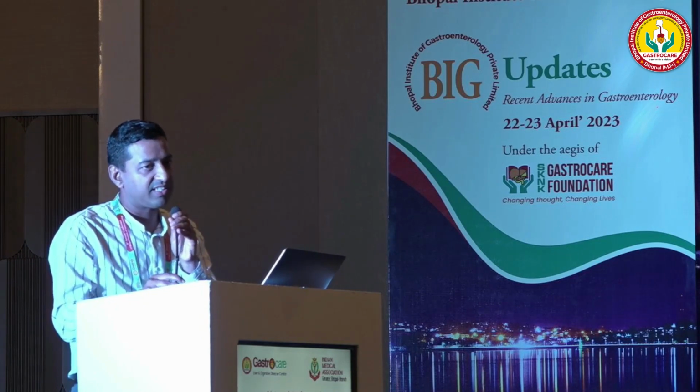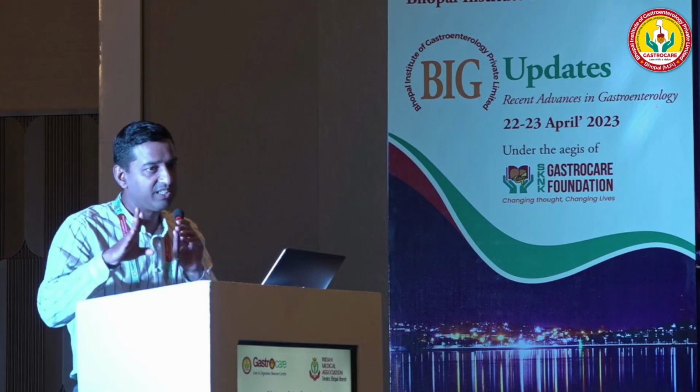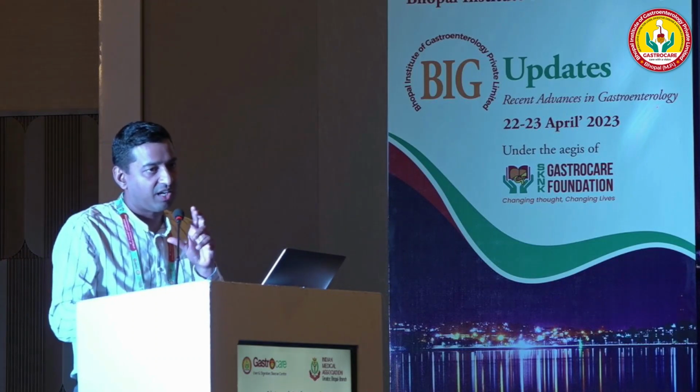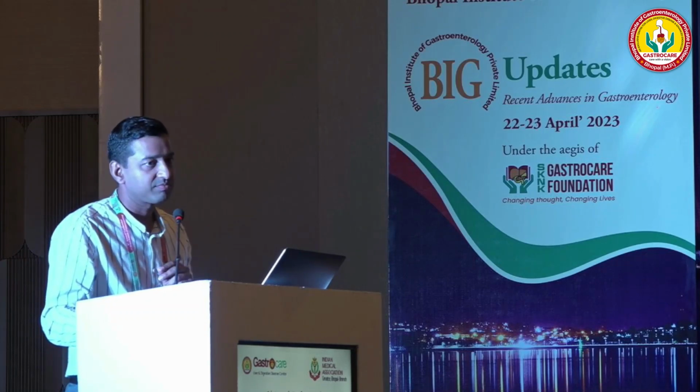Exactly. We did the same thing. We took up the patient for embolization. As soon as we saw the bleed, we embolized the left gastric artery at that point of time. Just to clarify, after the cystogastrostomy, this patient underwent 2 sessions of DEN. After that, in the ward, he presented one day with melena. So then we took him for endoscopy. At that time we saw the bleeder, so then we called for radiological intervention.